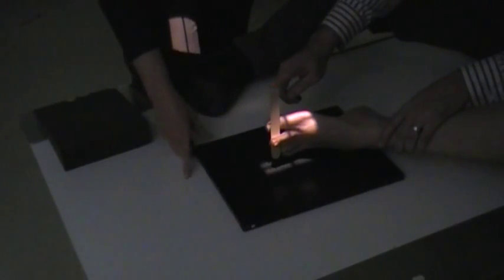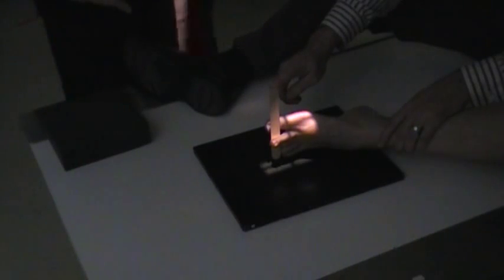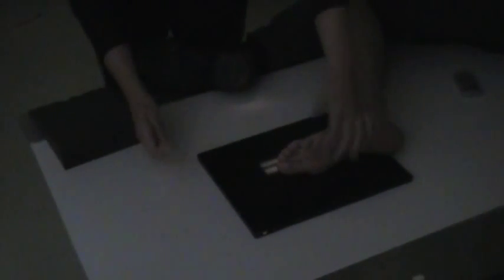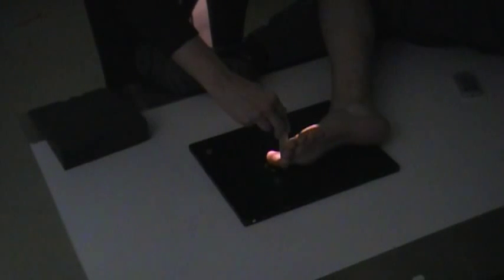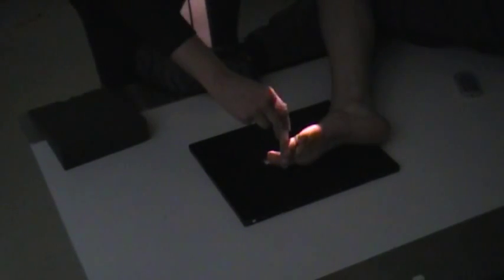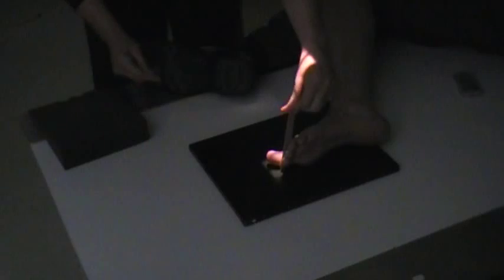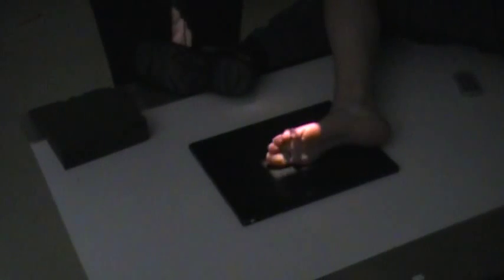We've got the second digit there. Usually, oftentimes when you're imaging the big toe or maybe even the second toe, you can roll the foot in medially and then separate it that way. The problem is, a lot of times when you do this medial rotation, it's very difficult for the patient to roll it in. But if they're able to tolerate that, then go ahead and get the body part closer to the IR for a better detailed image.